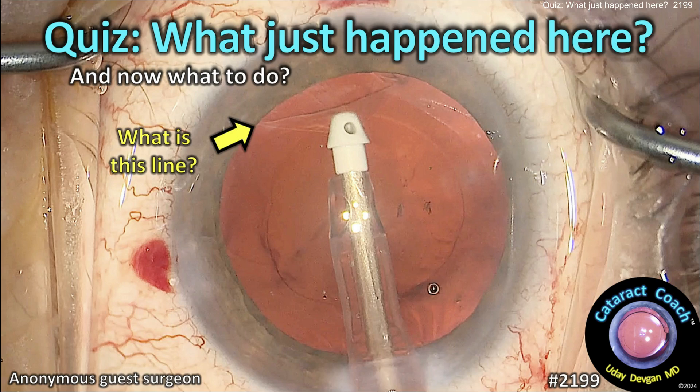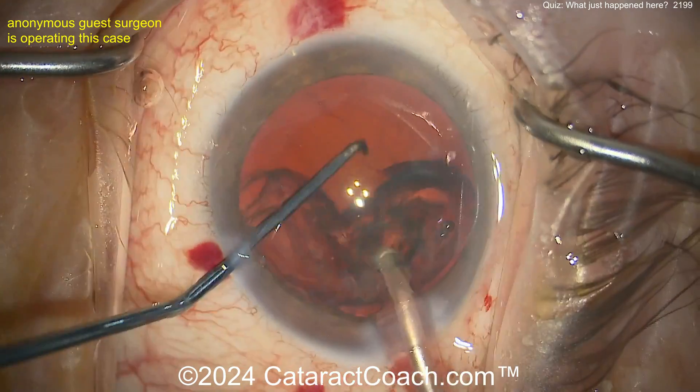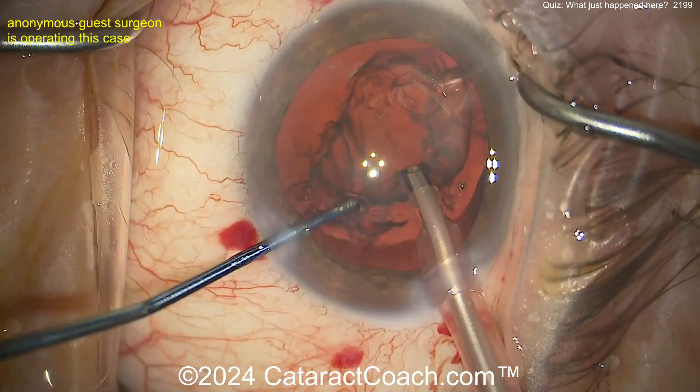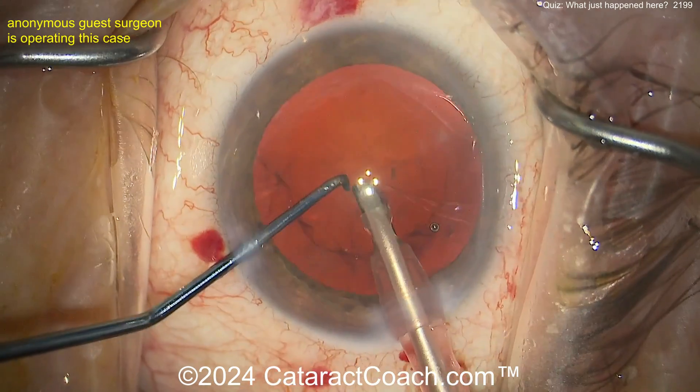Cataractcoach.com cataract quiz: what just happened here, and now what do you do? What is that line that you're seeing? Let's watch the case. Routine cataract case here, surgeon's doing a great job removing that epinuclear shell — get that thing flipped up and aspirated nice and carefully. Looks like a pretty routine case: good incisions, good rhexis.